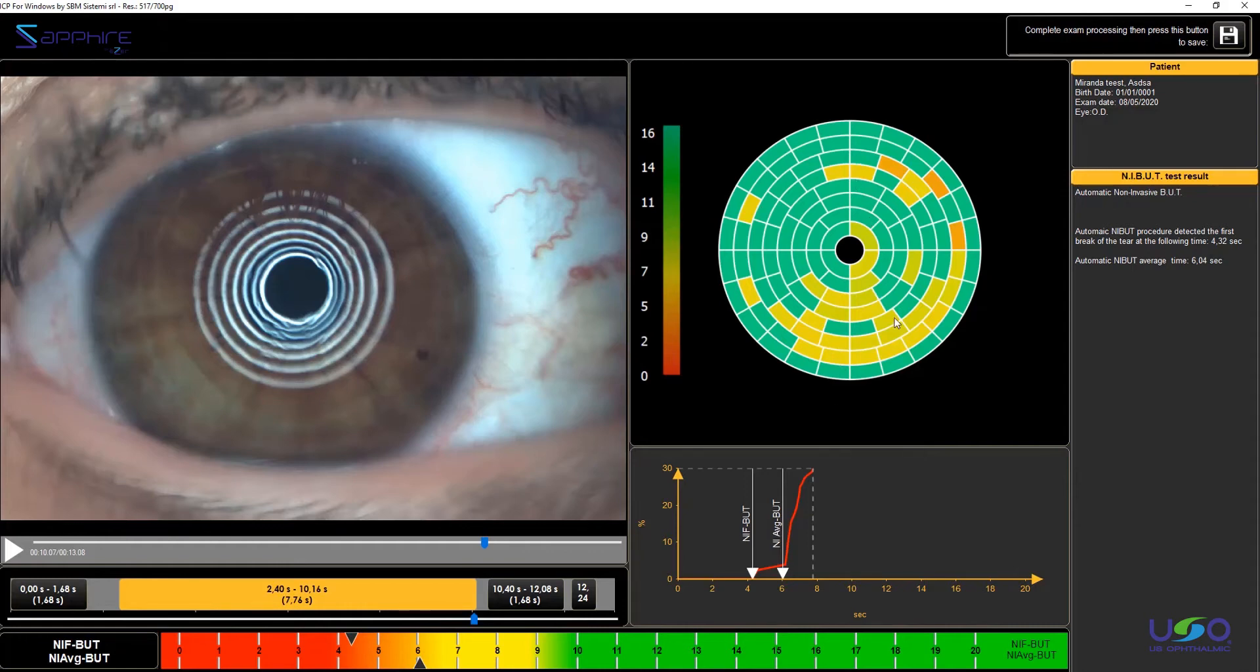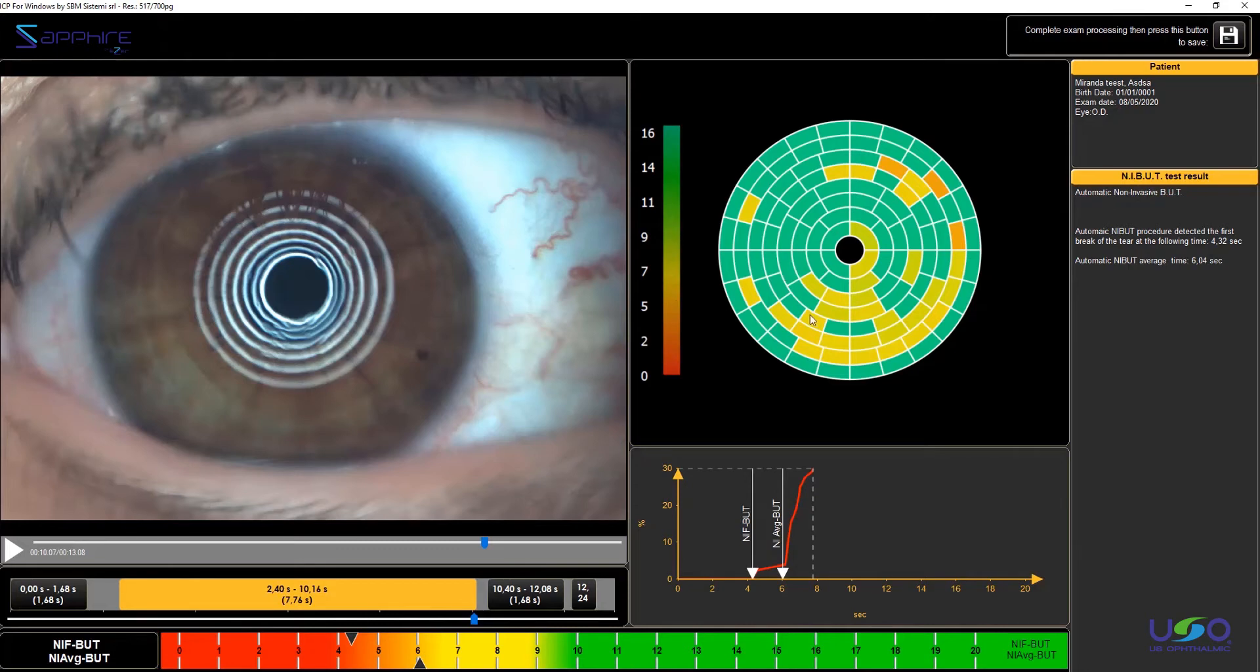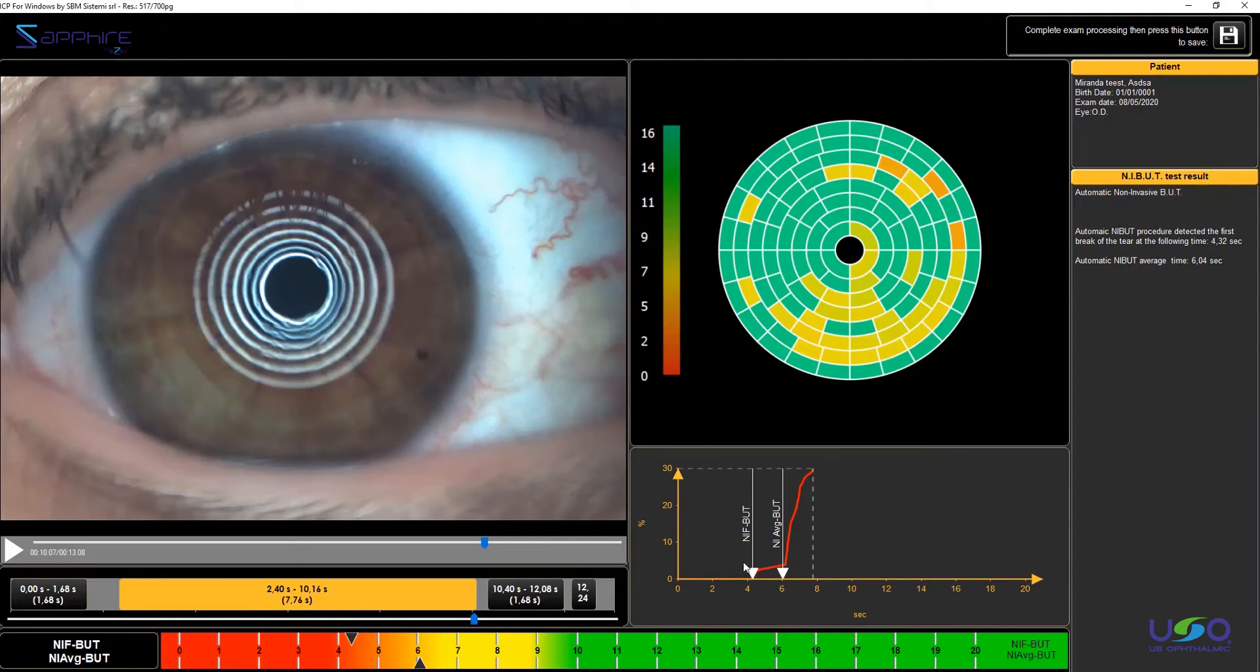What actually comes out in the view is two different graphs. The first one is a map explaining the position of the breaking on the cornea at a certain time. You can relate the color to the time to understand when and where the tear was breaking. The second graph you see is just a line graph, and is explaining in the time the percentage of tear broken on the surface detected. So this graph shows if the breaking is very quick, or is slow, or is moderate.